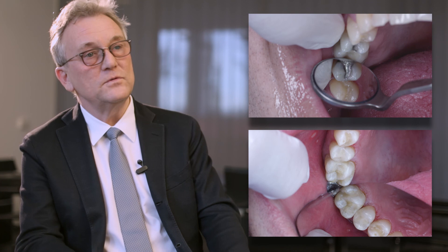Replacing an amalgam filling with modern composite material — in this case Venus Diamond — can be considered a success. In terms of aesthetics, the material has been superbly integrated into the oral environment. The patient left the practice very happy with the result.